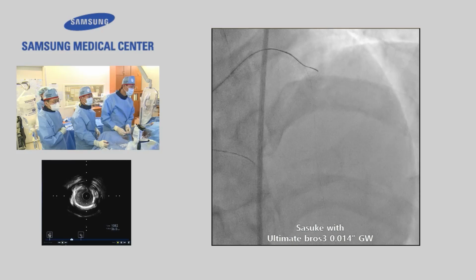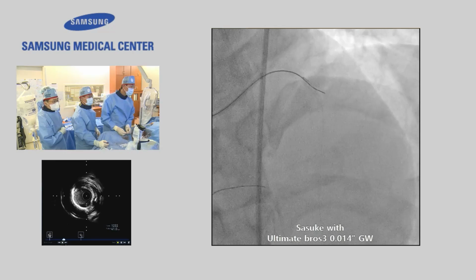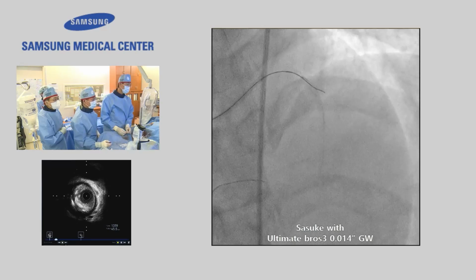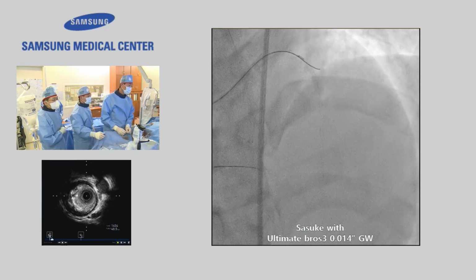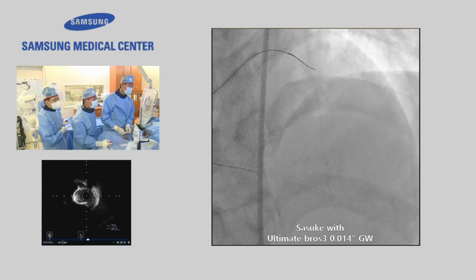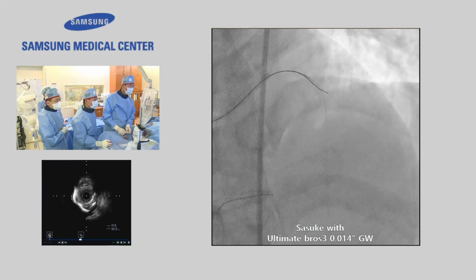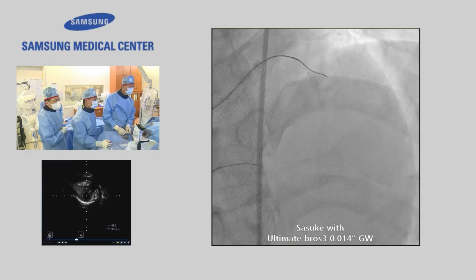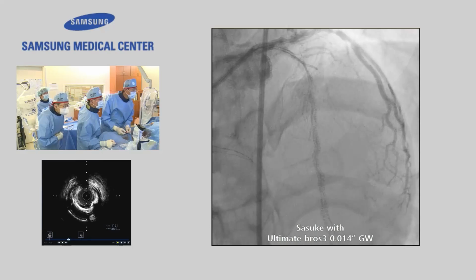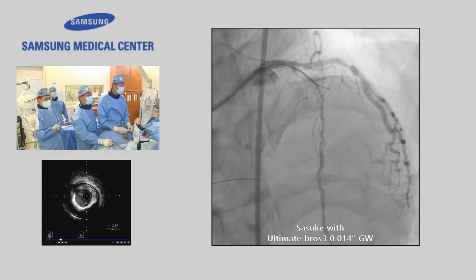I'm pulling back. I'm happy about the angle of the wire, actually. We should go 5 o'clock. Andrew? Sure. Yeah, we should go 5 o'clock at this point.